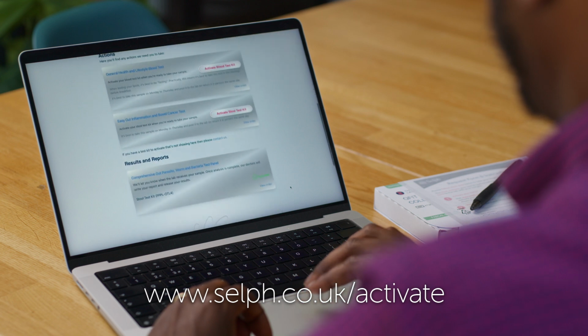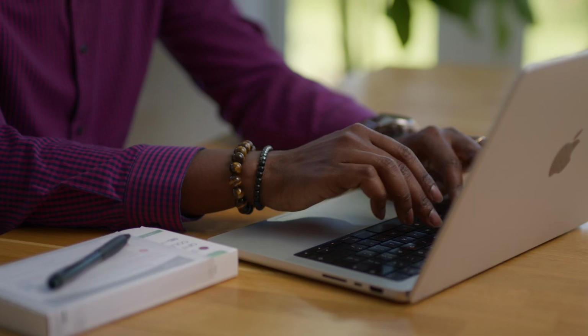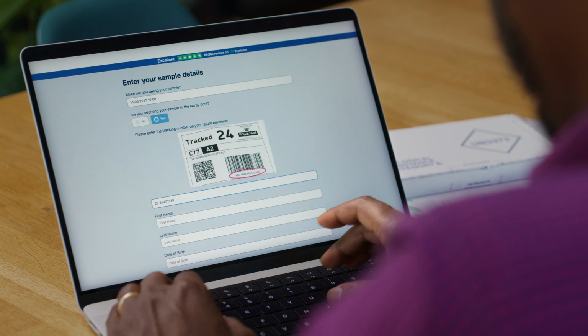First, go online to your Selph account and follow the steps to activate your test kit. Activation is really important, and without it, the lab won't be able to analyse your sample. You'll also see any special instructions related to taking your test. Once you've activated your kit, you're ready to take your sample. It's a good idea to read the instructions so you know what to expect.